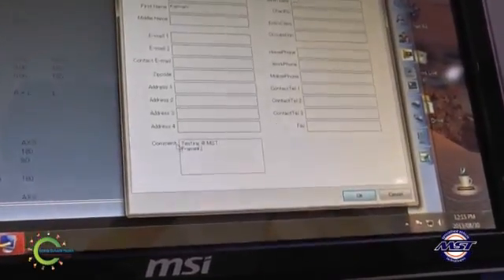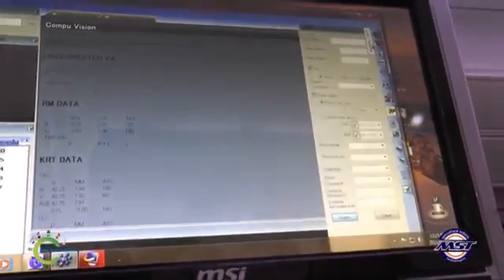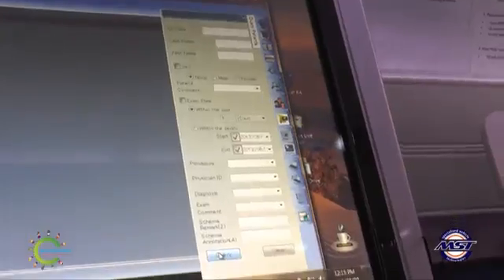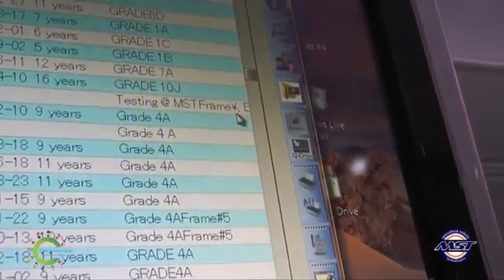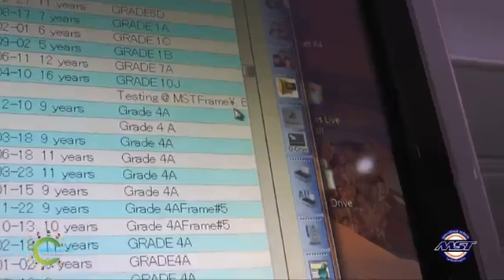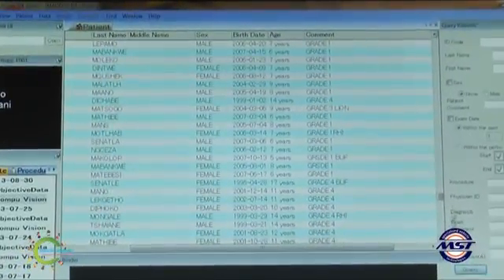To ensure that your frame order has been stored, return to the query page. This time, do not enter the unique patient ID code. Instead, click on General Query. Previous patients from the course of the day will be listed. Now check that the frame name or code is stored next to the unique patient number.